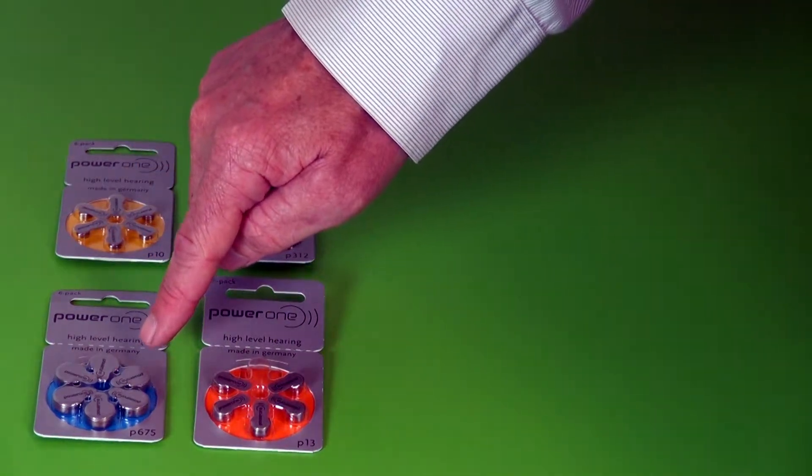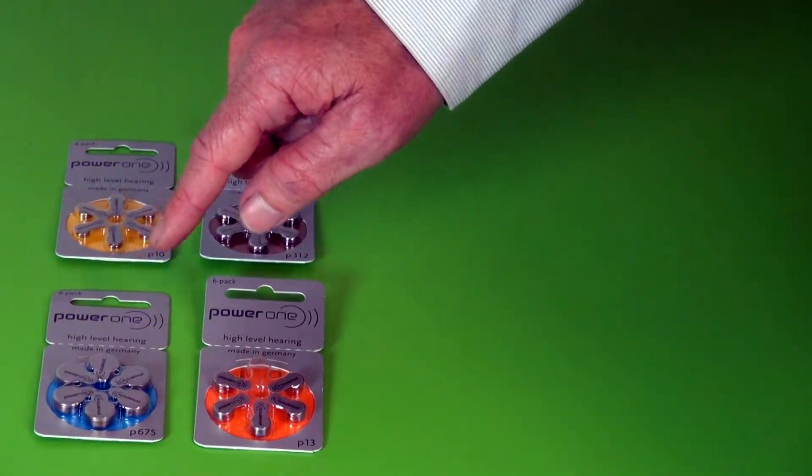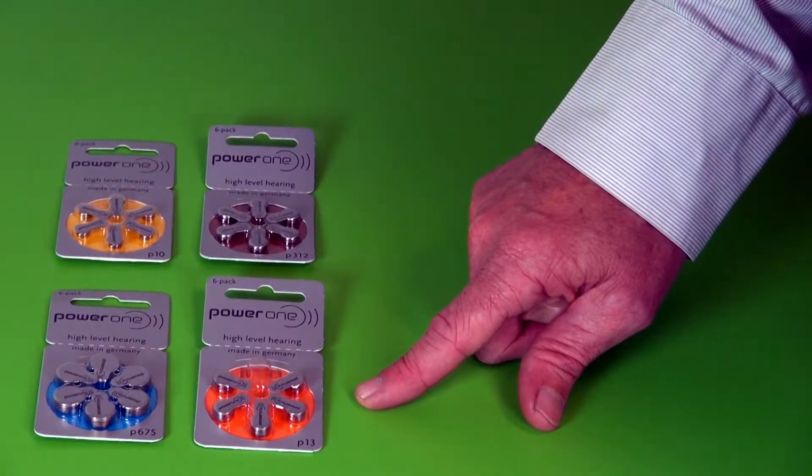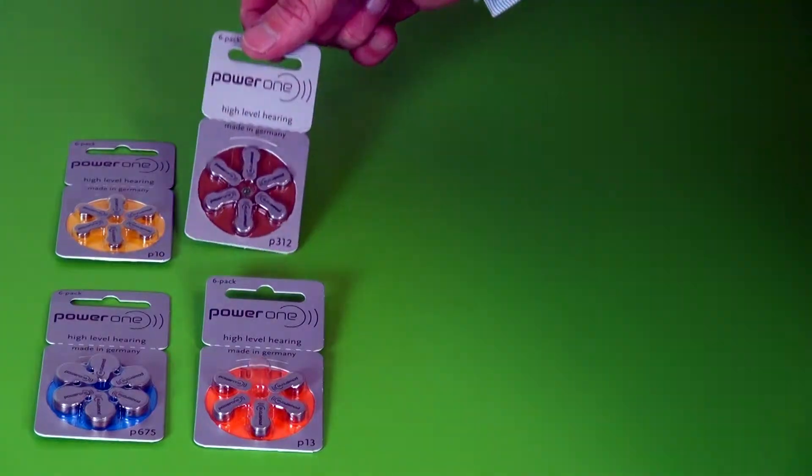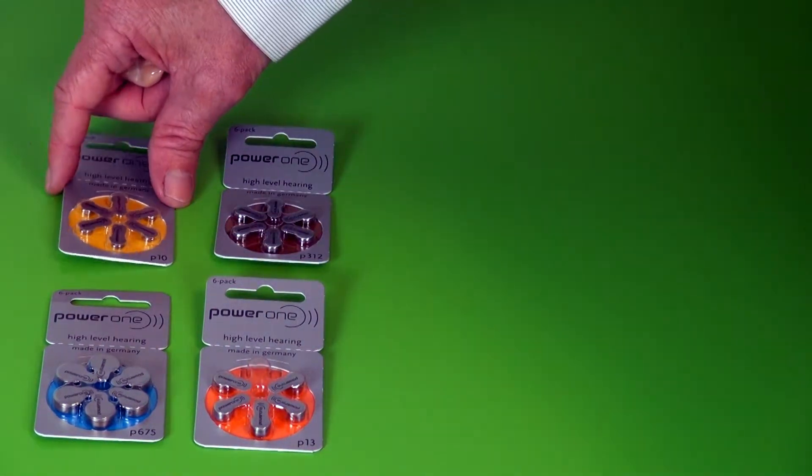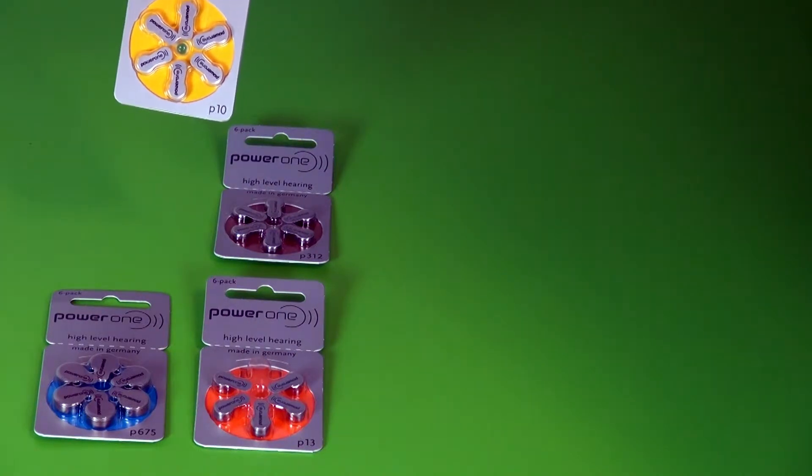The largest size is a 675 that has a blue background. The most popular size is an orange background with size 13 hearing aid. A size 312 has a brown background and then the smallest battery is a size 10 which has a yellow background.